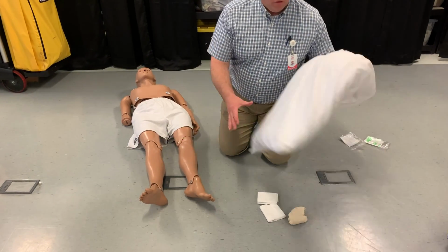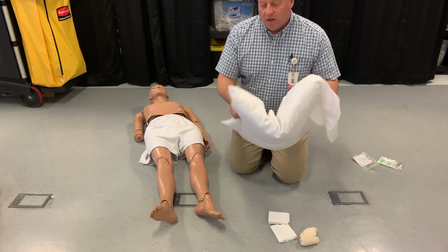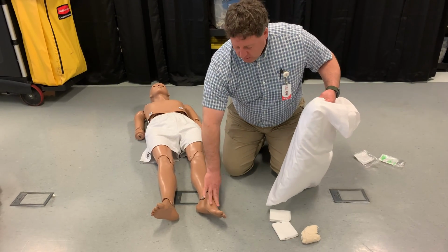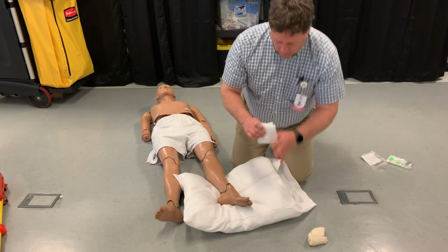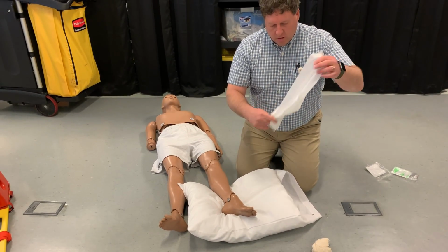All right, a pillow splint is a great way to do an improvised splint. They're soft, they form around just about anything. I use them primarily for foot and ankle type injuries. So I have my partner holding it, check circulation, sensory, and motor. And really all we do is slide it under and it will wrap around. We have to secure it somehow, and that's where I like triangular bandages best.